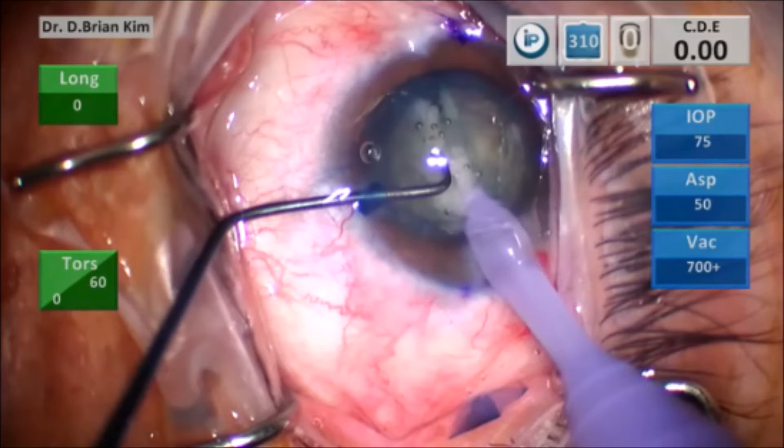Again, please appreciate that the vector forces are centripetal. As a result, there is not significant zonular stress. This is an Alcon balance tip.